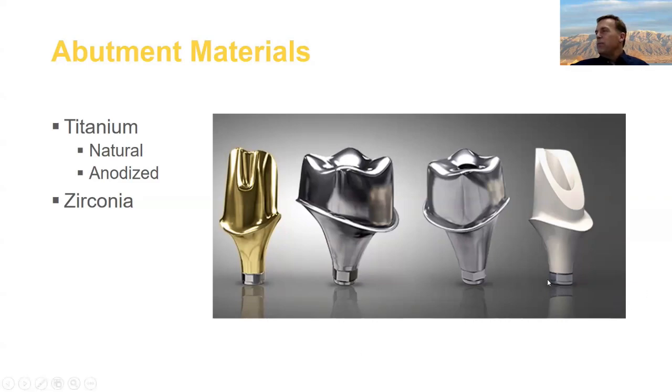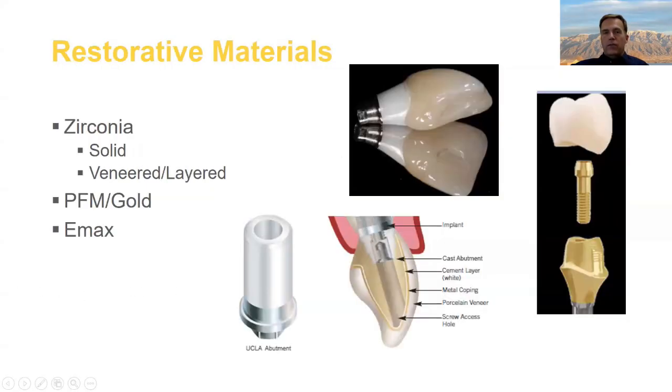Most of us labs have been bit a time or two on this, and we're not as keen on these. But I would say there's more and more manufacturers who are coming out with a titanium interface on a zirconia abutment. And that can be a really, really nice option for your cosmetic cases.